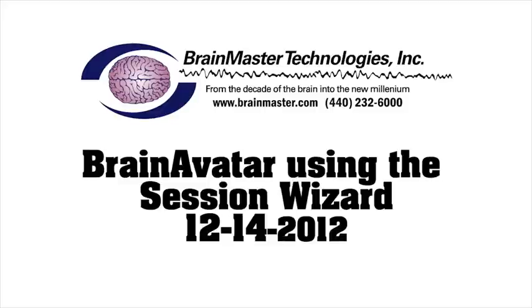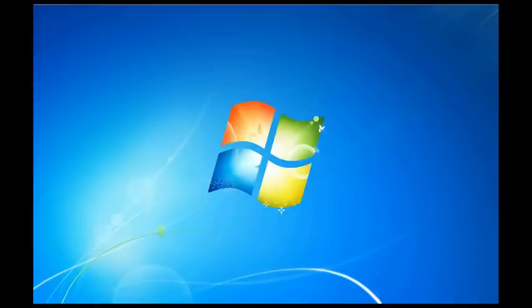Now, before I really get into the details, what I want to cover today is what SessionWizard is, so you understand exactly what I'm referring to whenever I say SessionWizard. The other thing I want to get into is where the information is, how you can get to it, how you can utilize it, and the final thing, more in this one than in the EventWizard, is how you can use SessionWizard for what you're doing.